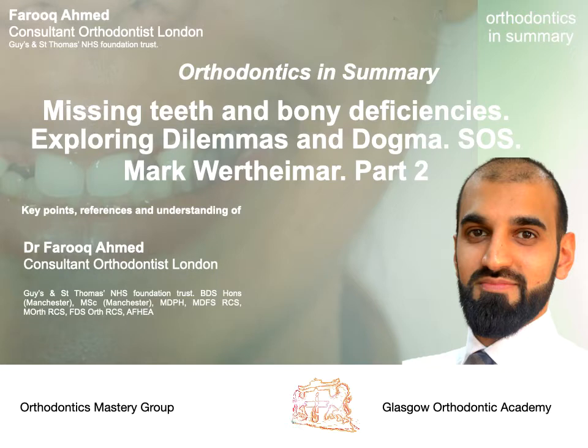The second issue is that of torque, and the aim of disguising the canine eminence and moving the canine root palatal as opposed to the typical buccal position it occupies. Now there are numerous methods to do this. One can use a canine bracket and invert it. One can use a central incisor or lateral incisor bracket with surface modification.